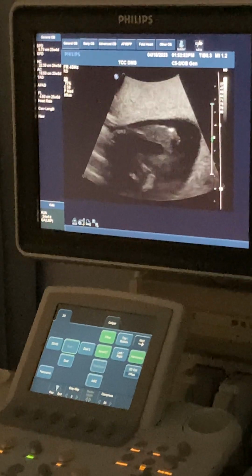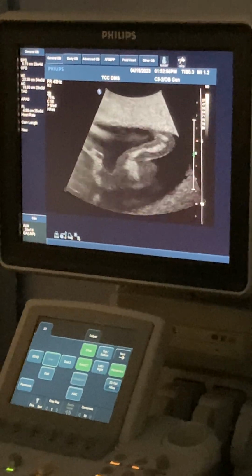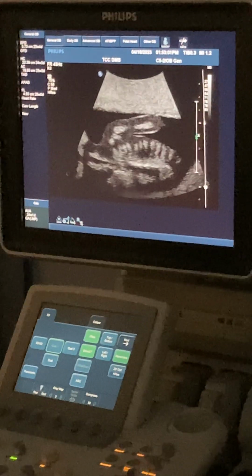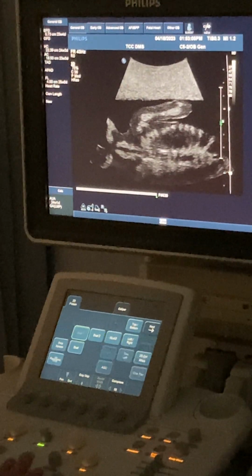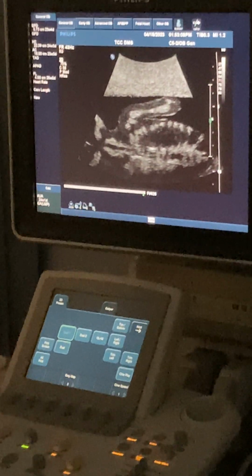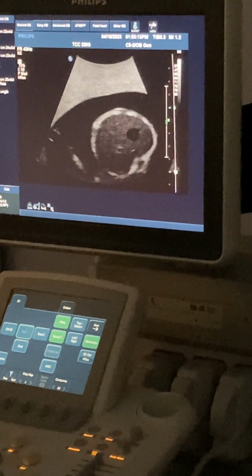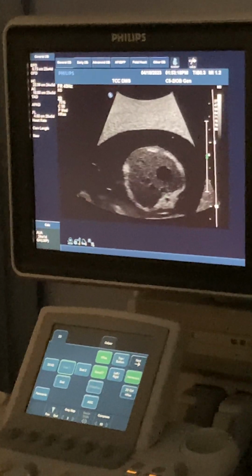She's not making you do all the long bones, right? Just the humerus. No. Okay. This baby's humerus bone is crooked. Strong. There. And then is there a specific spot that you want it to be, that she wants for biometry? You mean included in biometry? Yeah. No, just do it.